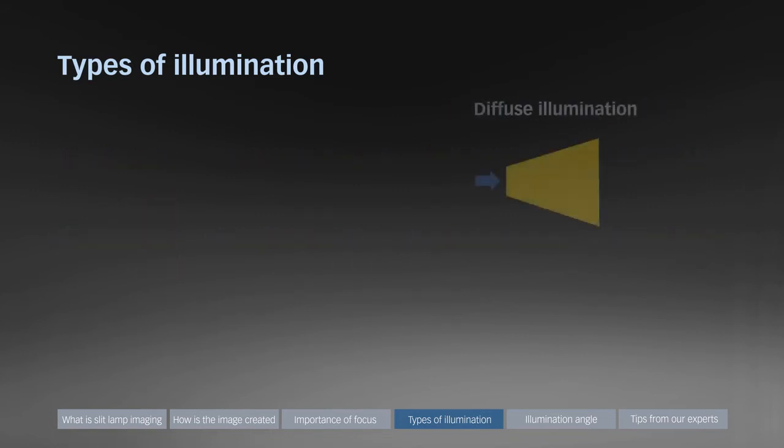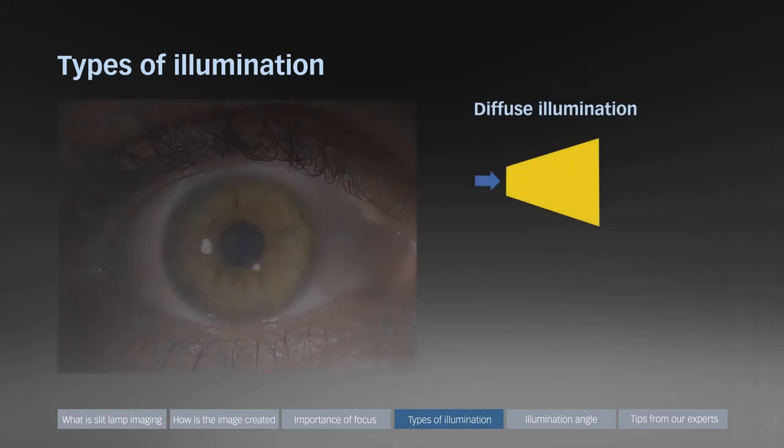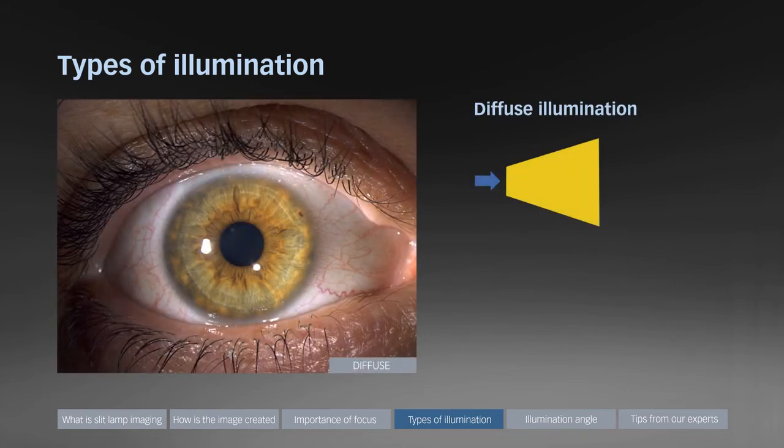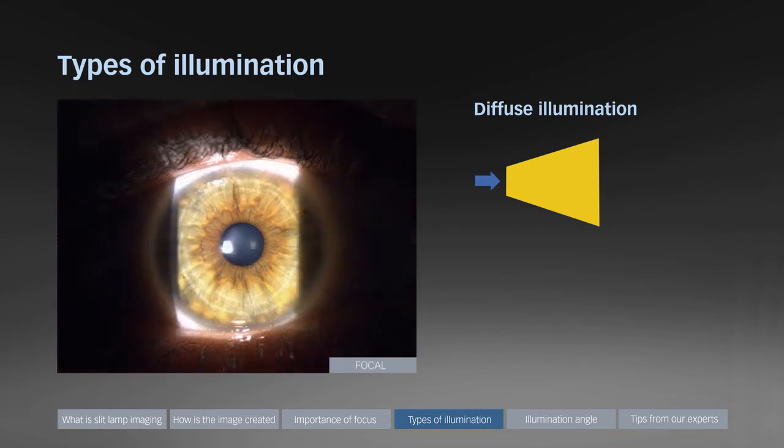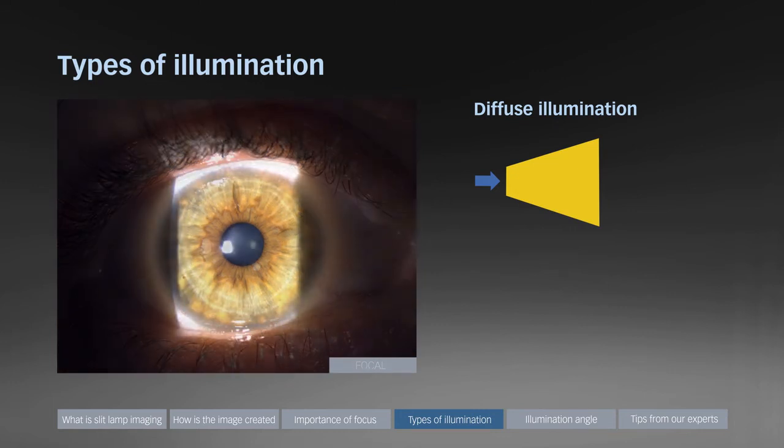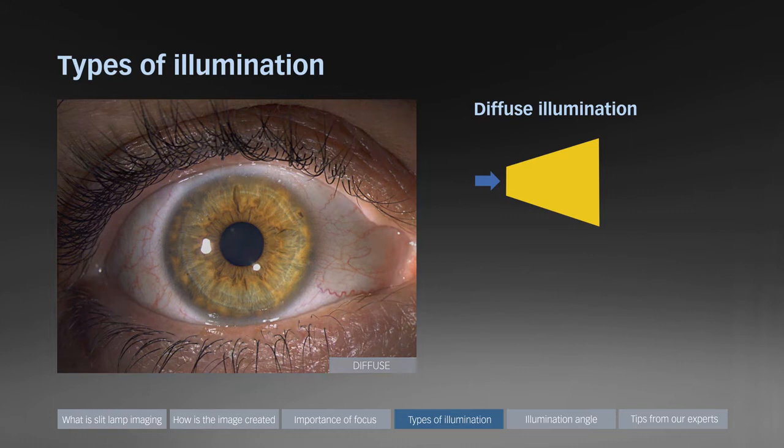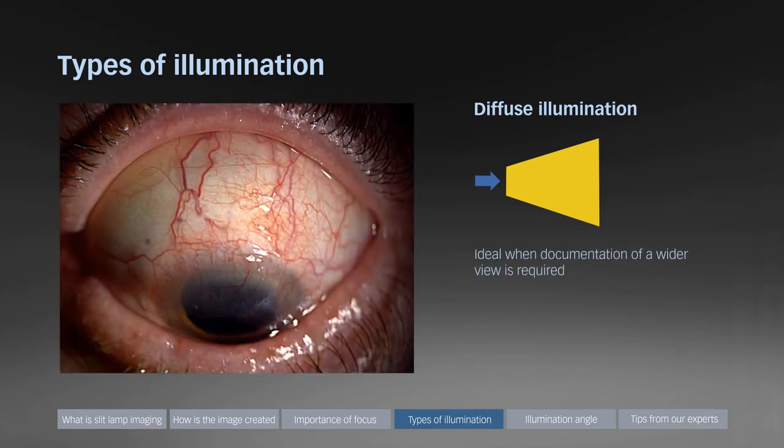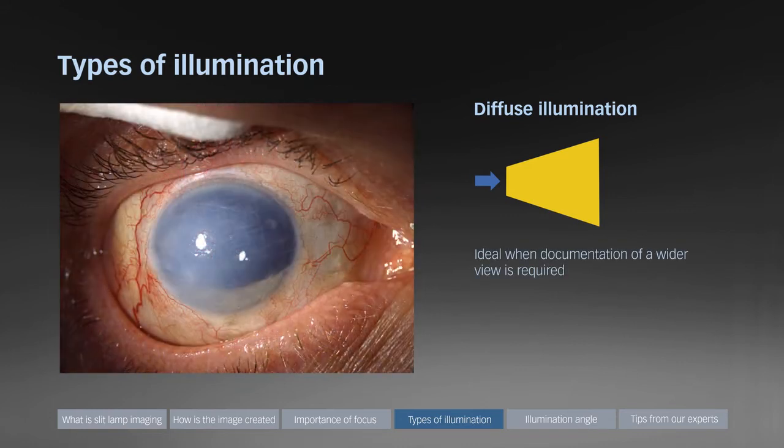Diffuse illumination provides even light distribution. For comparison, the same eye with direct focal illumination and here the diffuse illuminated version again. Diffuse illumination is ideal when documentation of a wider view is required.